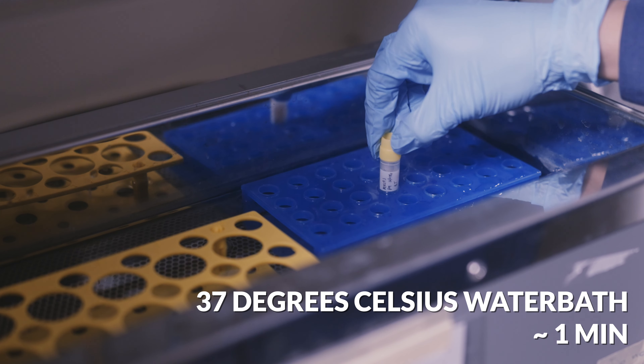To resuscitate the frozen cells, you will need pre-warmed media to provide nutrients for the cells, pre-warmed phosphate buffered saline (PBS) to wash off any toxic chemicals, and racks and pipettes to transfer the liquid to and from tubes and flasks. Spray all of these with 70% ethanol before bringing them into the hood. Add pre-warmed media to a sterile centrifuge tube, then pipette the entire contents of the thawed vial into it. Try to pipette down the side of the tube to let the media gently drip to the bottom.